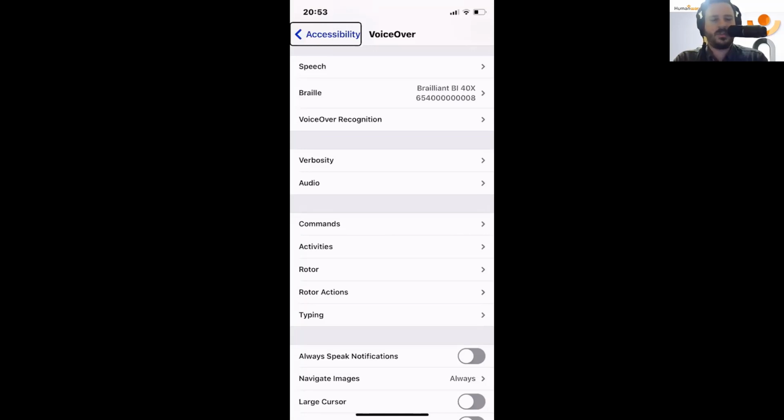So what we're going to do is talk about working with NVDA. And with that, what Andrew showed, customizing your Braille commands, I always like to show something very basic. And then we took a full advanced, beyond advanced sort of piece and showed how you can customize your Braille commands to really demonstrate that it is more than just emulating VoiceOver gestures with a Braille keyboard.